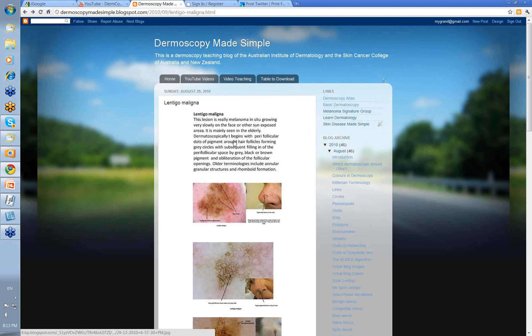Dermoscopically, they usually begin with perifollicular dots of pigment around the hair follicles, and these form gray circles. Then you get subsequent filling in of the perifollicular space, either by gray, black, or brown pigment, and ultimately obliteration of these follicular openings. The terminologies that describe this process include annular-granular structures and rhomboid formation. We'll come to these when we see some of the images.